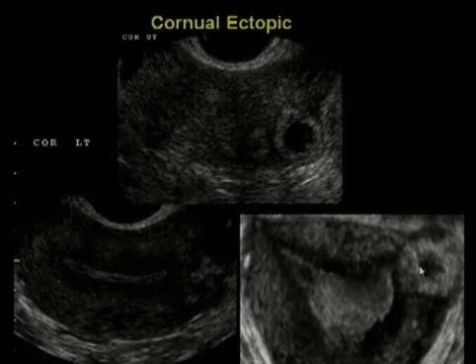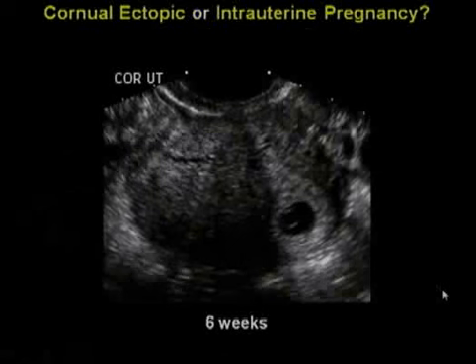This is a cornual ectopic pregnancy that we were pretty sure of on the regular ultrasound and became completely sure on the 3D ultrasound.